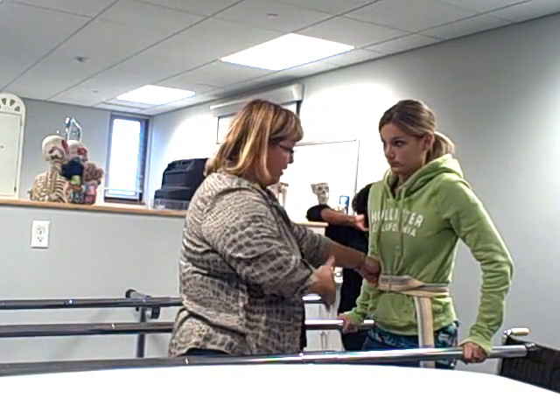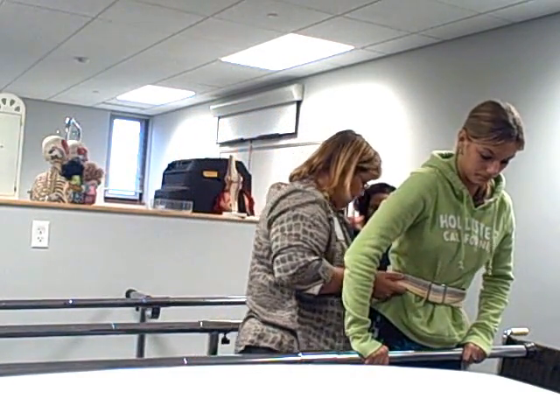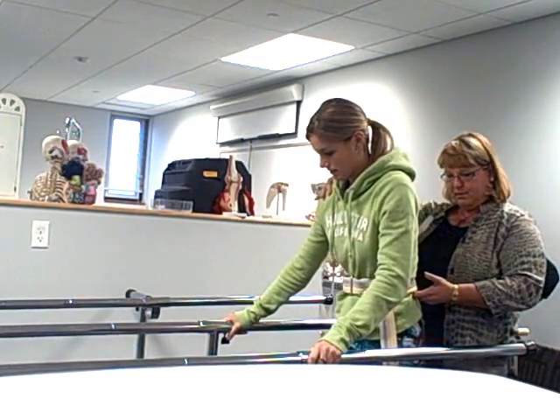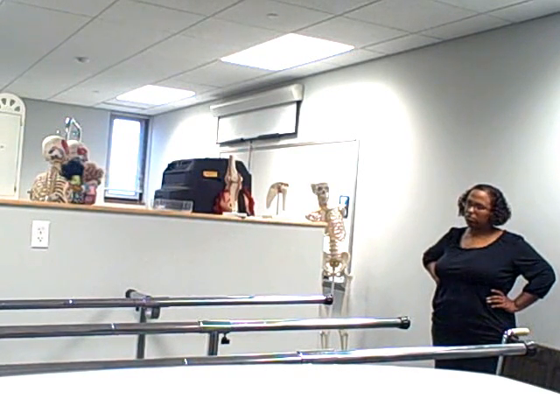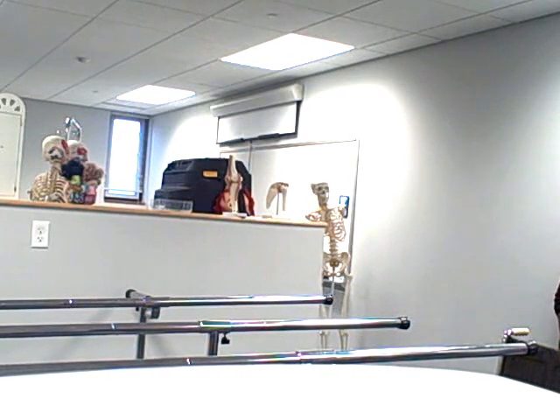So I can get in a better position here. It doesn't matter which way she turns for this. I'll have you turn toward the parallel bar so I can slide behind you. And I'm keeping one hand on the gait belt at all times. I'm going to turn back toward the end there. Go ahead and bring your hands forward, and then bring your hips in between the hands. She's kind of already progressed — that's okay as long as she's under control. She's going to go into a swing-through rather than a swing-to, so that's fine. Now I'm going to have you turn — do you remember which way? Try it toward your strong side. Good job keeping that foot off the ground.